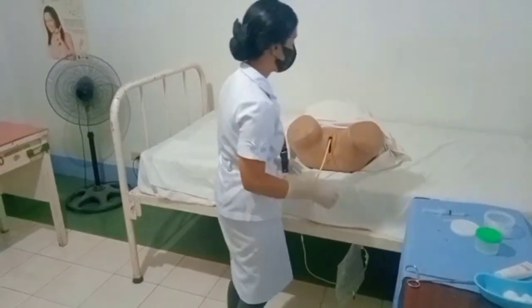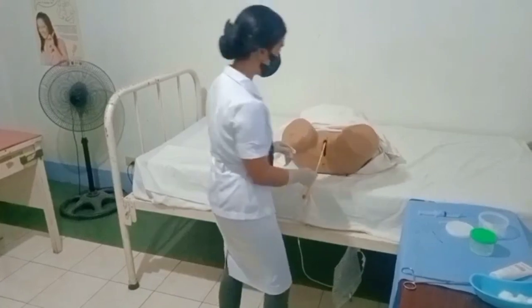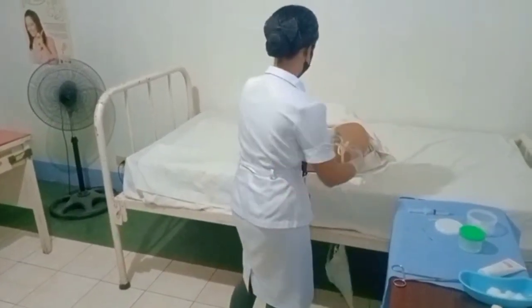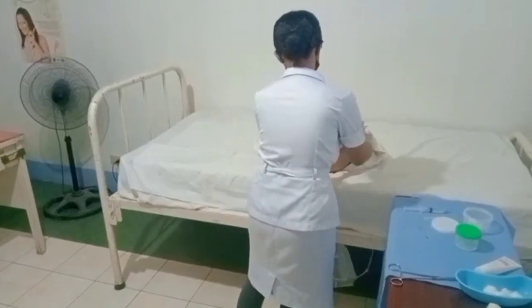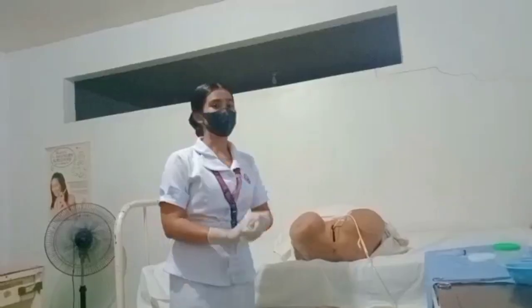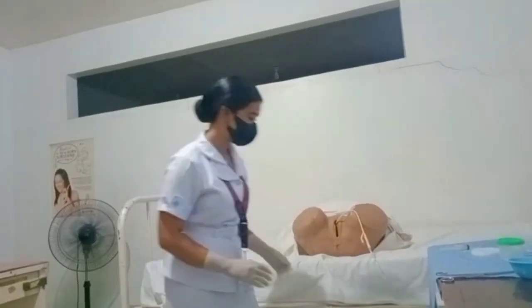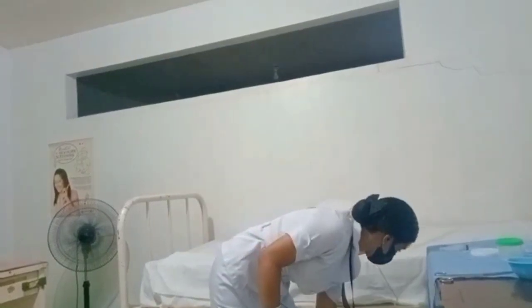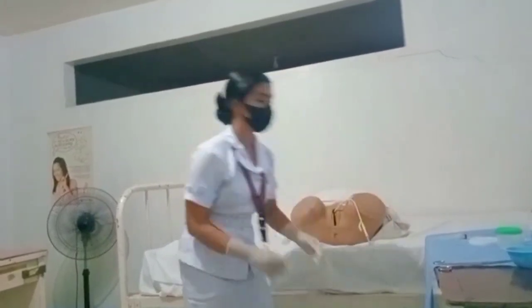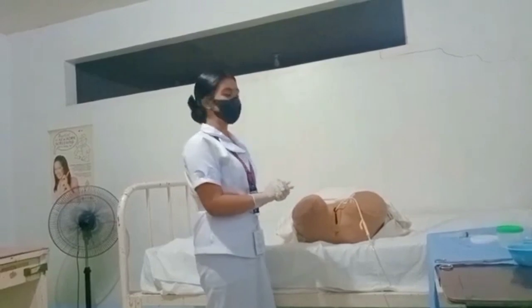And then I am going to tape the catheter on the thigh. Then I will place the drainage bag below the level of the bladder. And then I will assist the patient in a comfortable position.